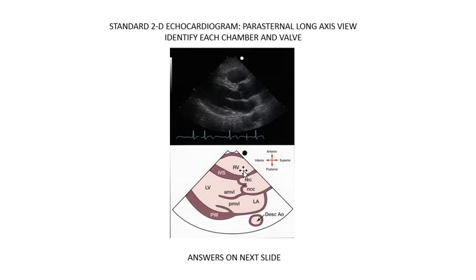So here we have that. Right ventricle, the uppermost structure, the interventricular septum. I guess I should have pointed that out in relation to the posterior ventricular wall, where you can see pericardial fluid if you have pericarditis. The descending aorta is shown more clearly here. And you have the left atrium here, posterior mitral valve leaflet and the anterior mitral valve leaflet, left ventricle and aorta separated by the leaflets right here.